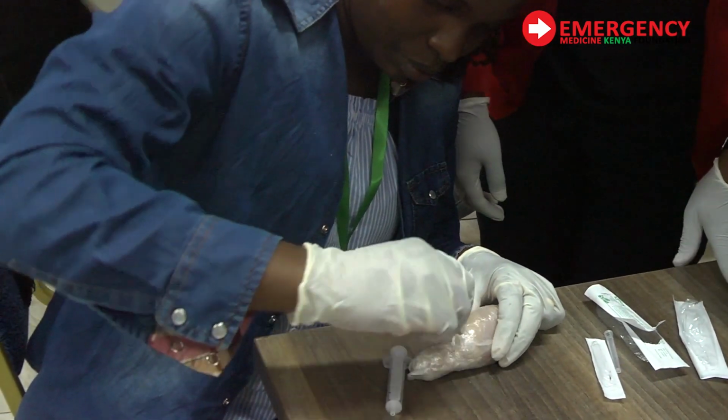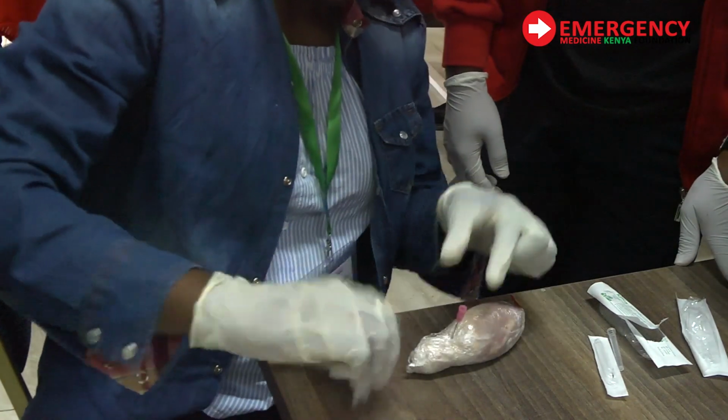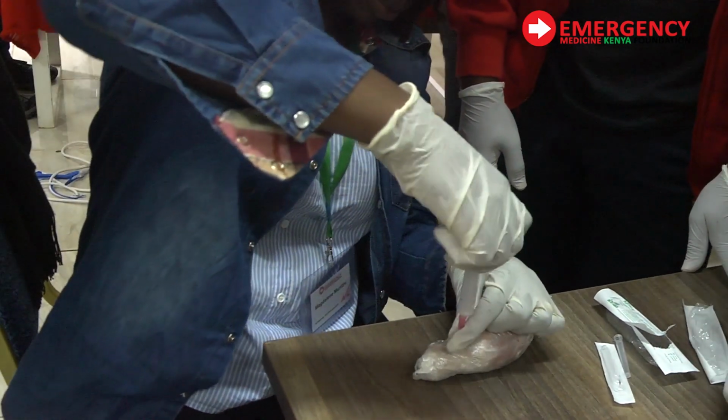And then try to use that. Yeah, good. So just do that. It will give. So you're applying some force as you go.